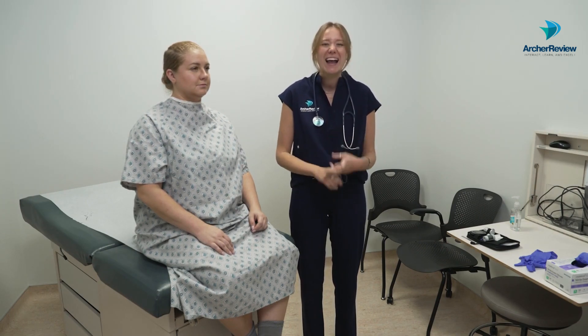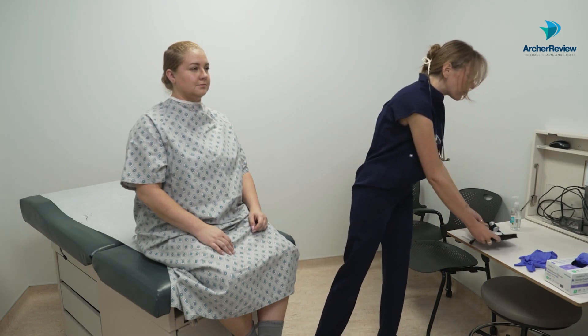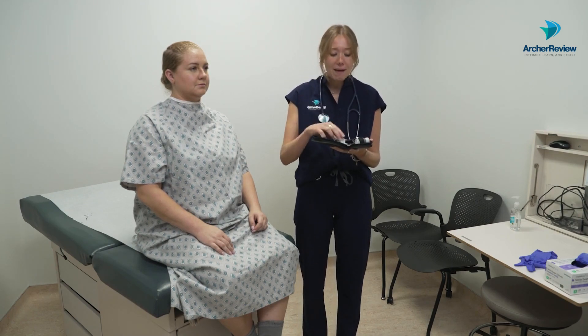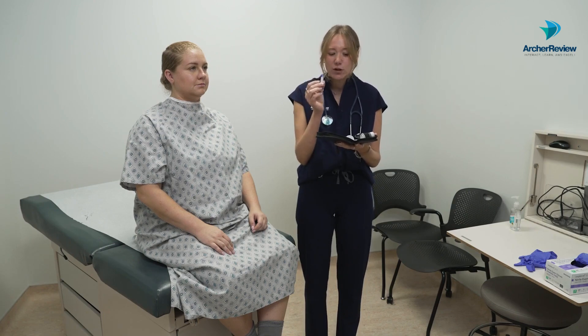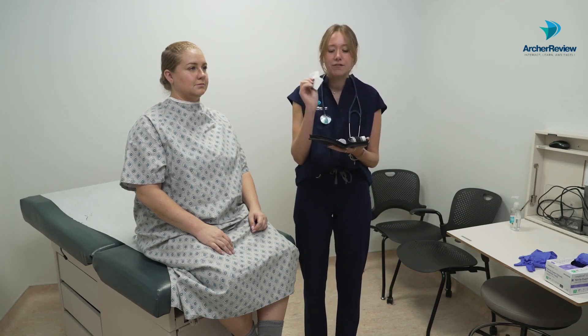Before you come into the room, you want to make sure you have an order to check a blood sugar, that it's the right time for the right client, and that you've gathered all of your materials. You need gloves in case there's any blood, glucometer strips that match your glucometer, a lancet — the tiny needle we're going to poke them with — an alcohol swab, and a piece of gauze to wipe off that first drop of blood.